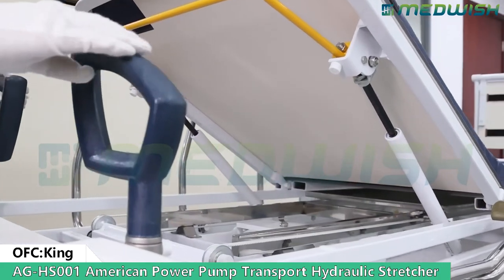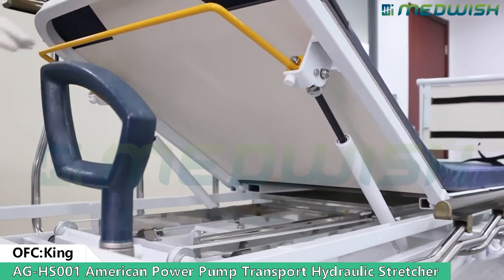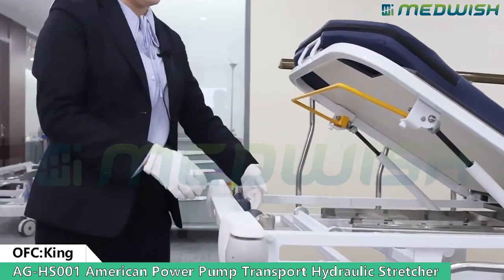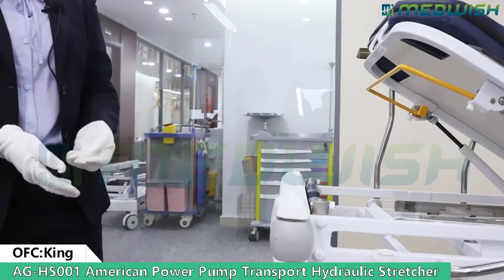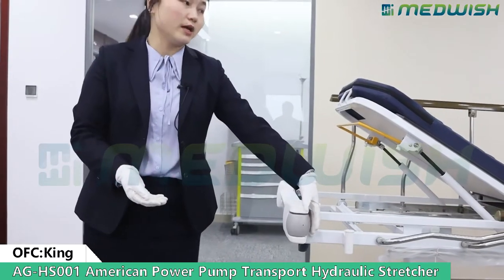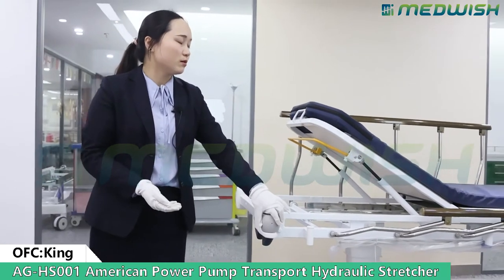To move the stretcher there are two holders. They are foldable type and can be hidden here. Also there are four bumpers for anti-crushing the wall while moving.